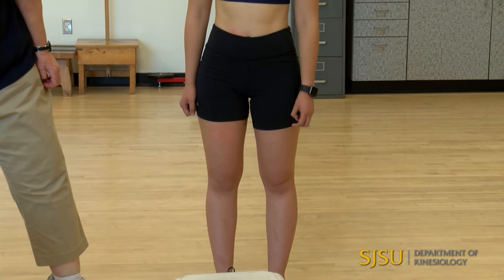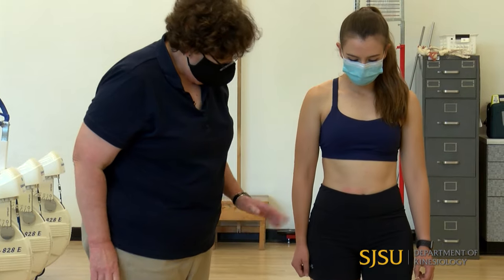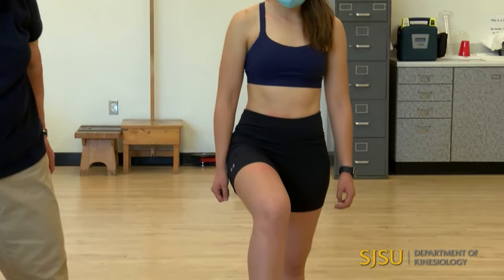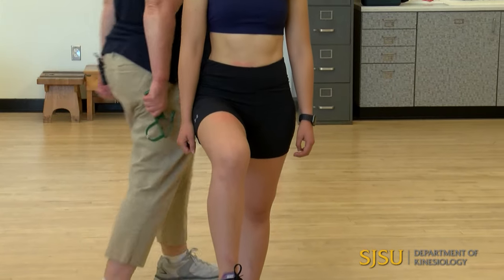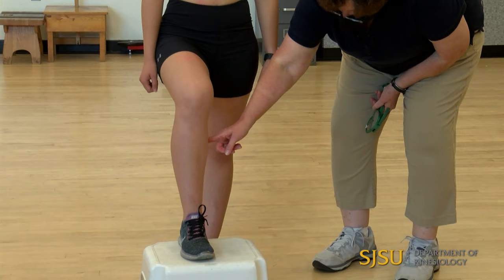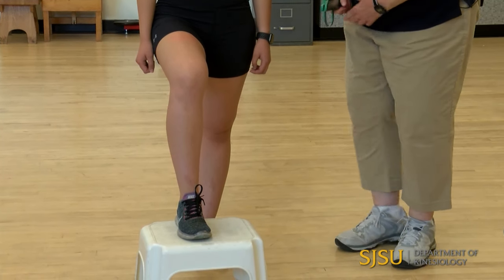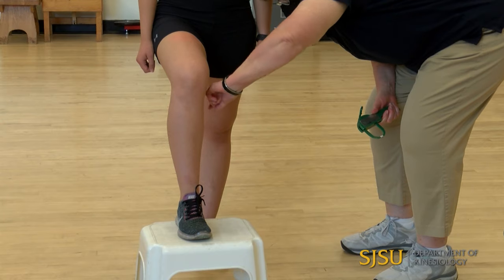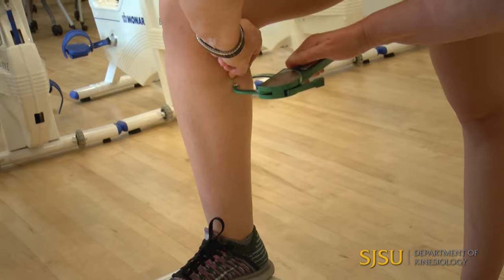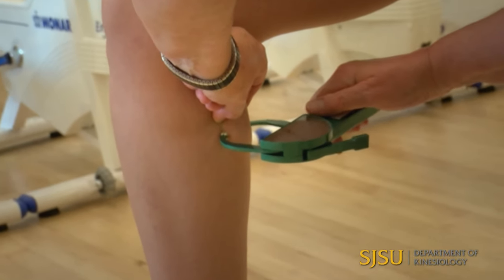The last measurement is the calf. The hip and knee are flexed to 90 degrees. I measure on the medial side at the level of the widest part of the calf. I pinch above — it's a vertical skinfold on the medial side.